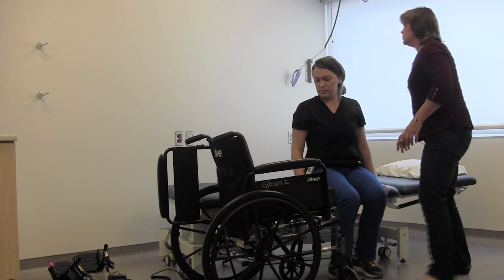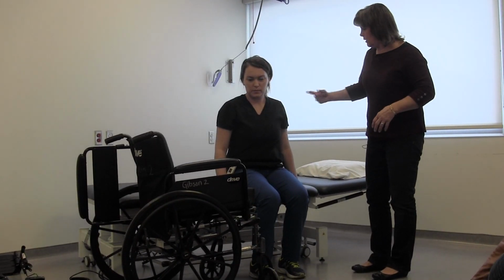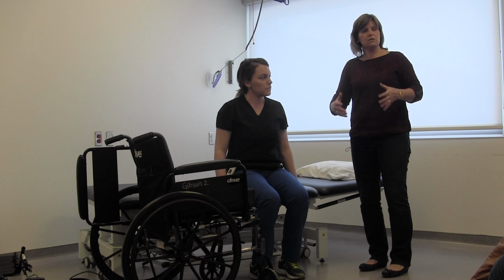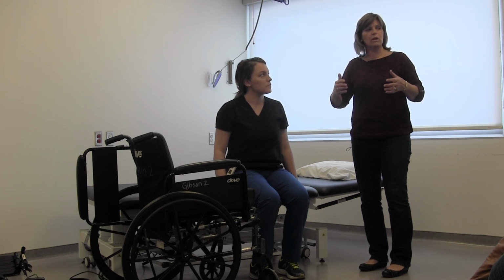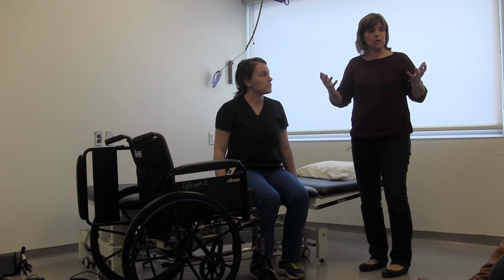Okay? So it doesn't matter which side is your affected side. We have the right side in bed, but in order to see things better, I think we'll use your left side as your affected side. And it doesn't matter where the chair is on the clients. When we're working with them in their therapy areas, we actually work going both to the right side and the left side. Because in a functional world, you need to be able to transfer both ways.